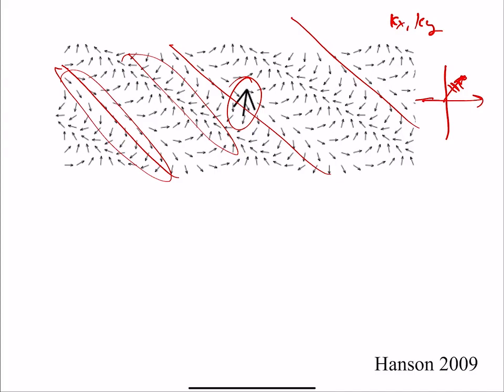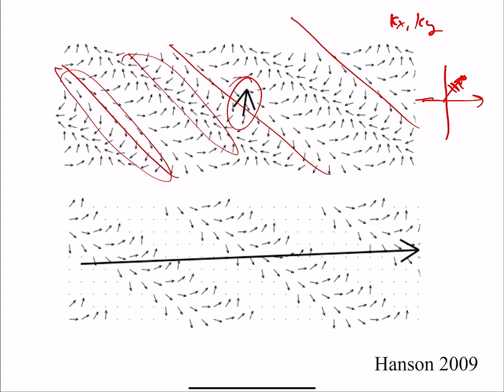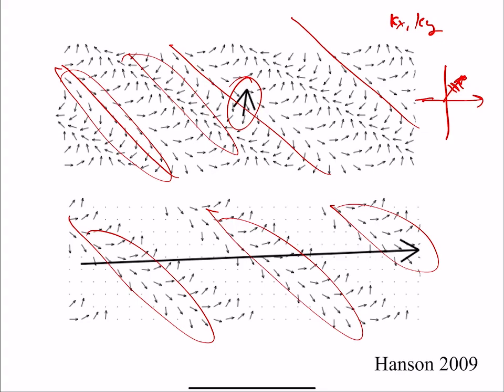So we can think about cutting out parts of the object. All those spins that were canceling out the other spins, we just remove them. It's like with a bar of chocolate, we just cut them out and throw them in the trash. Now we have an object that has stripes in it, so now all these spins can add up constructively. There's nothing to add up destructively, and so now I'm going to get a much bigger value for my Fourier component.